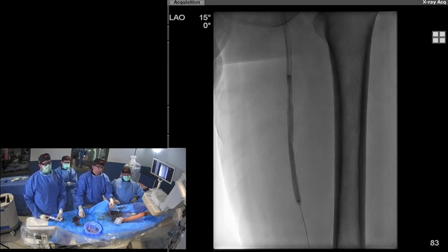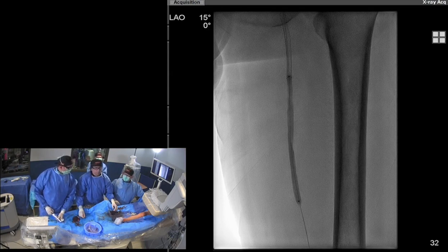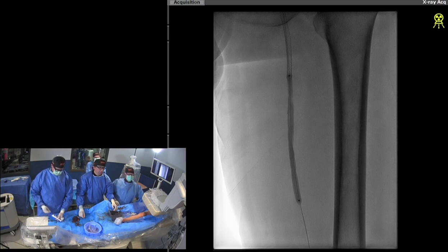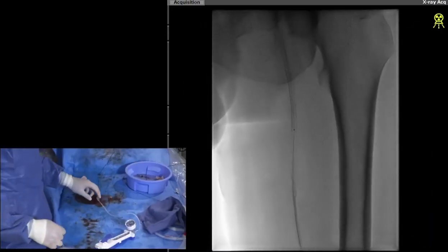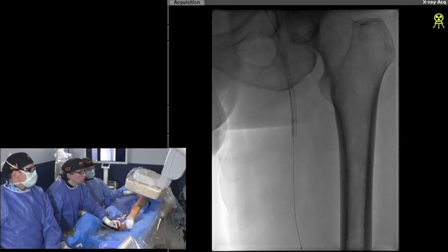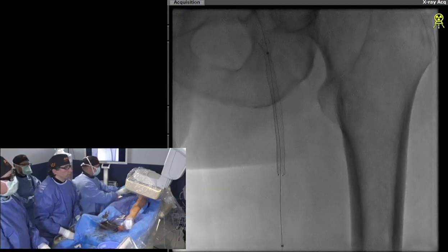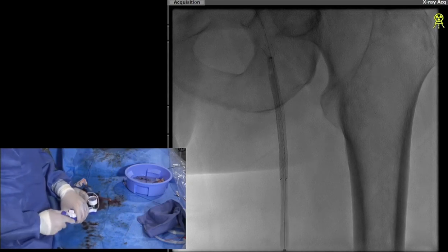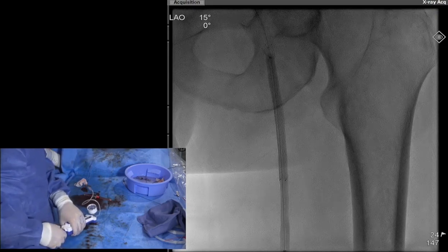We have five minutes left. I'd like to post-dilate the stent, show a final image, and do the remaining work in the popliteal. The balloon inflation time: aren't you the PI for the DCB trial? Three minutes — leave it up for three minutes. It takes time — there's no way to hurry. The instructions for the instructions are three minutes. Give us more time and we'll get you the full result.